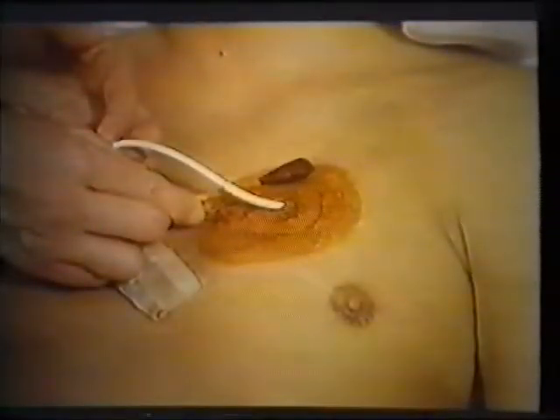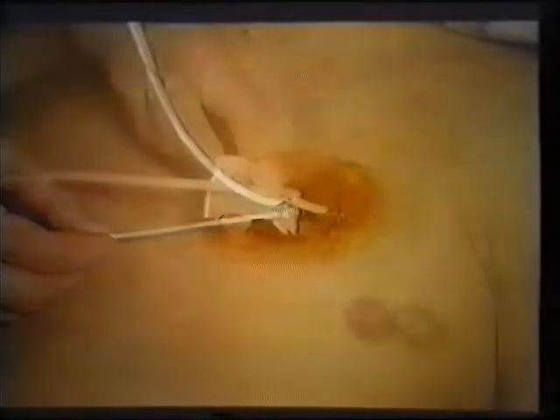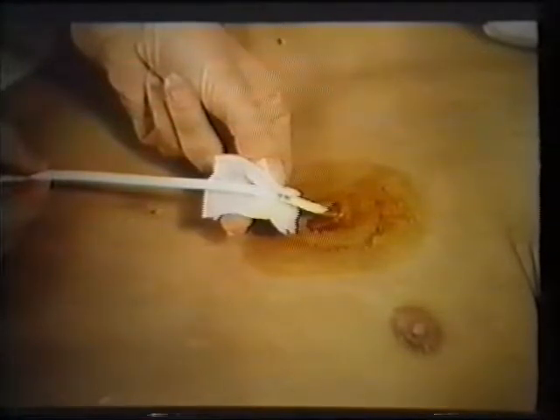When you finish cleaning with peroxide, dry the area with sterile cotton tip swabs. Re-clean the entire area with a povidone iodine swab using the same circular cleaning motion. Excess povidone iodine may be removed with a sterile swab or gauze pad. Apply povidone iodine ointment into the exit site with a sterile cotton tip swab or gauze pad. Use an alcohol wipe to clean the line from the exit site toward the adapter end of the catheter. Be careful not to contaminate the cleaned exit site.